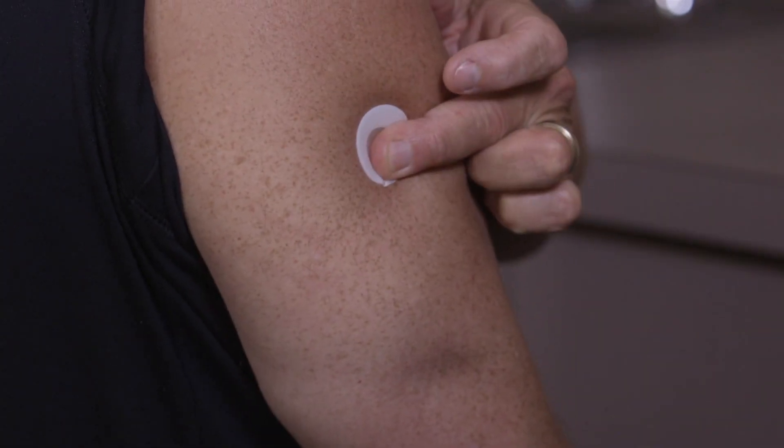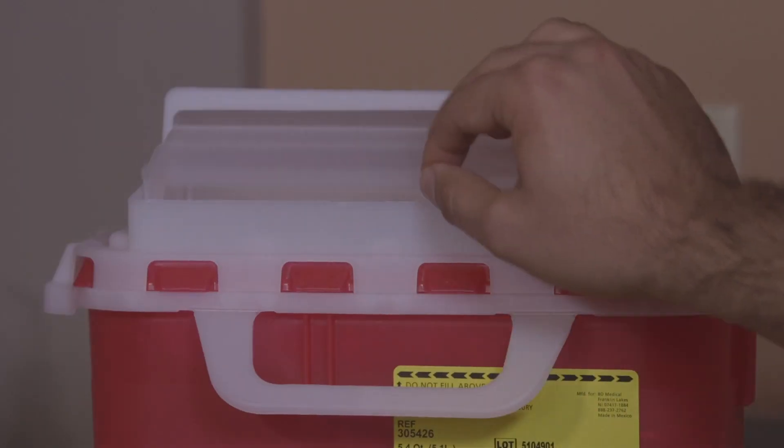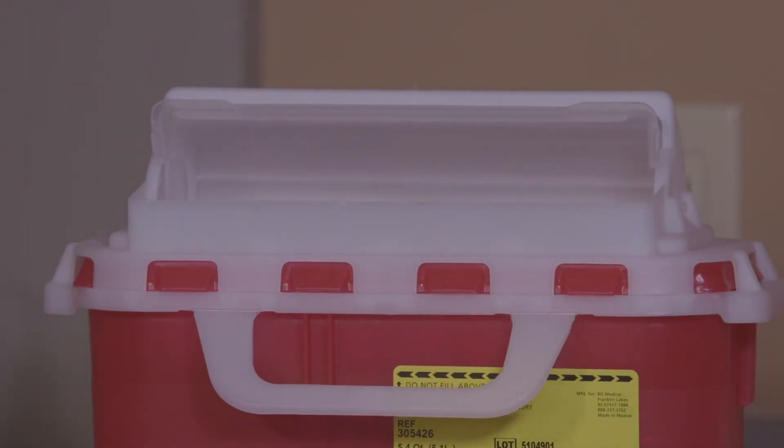The patient should apply pressure to the InjectSafe Barrier Bandage following the injection. After the procedure, remove and safely dispose of the needle in a sharp container.